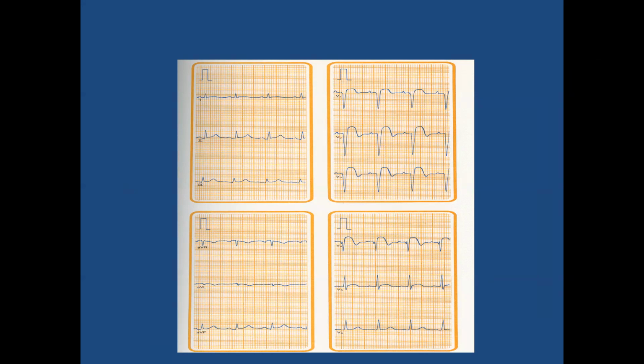Anterior MI. Yeah, anterior MI. But always tell the rhythm first. So if somebody asks you what is this rhythm, what would you say, Elvis? Because they will ask you that in IBHRE. If you don't say it, and you just say anterior MI, that's wrong.